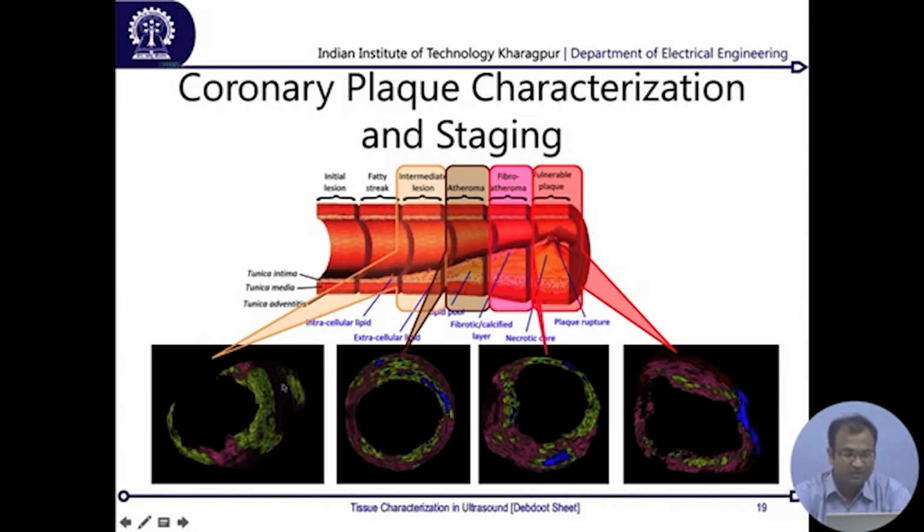Still it is going to predict, and there are no false positives coming up. This is a stage when, in these two stages, there is no necrosis coming, and it comes only over here. So there are missing classes in the data itself, and it's still very efficiently going to predict it out, including learning them perfectly.